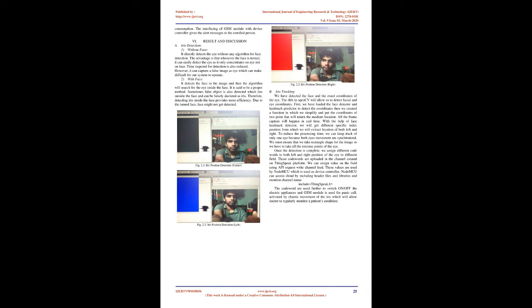5. Implementation. A. Raspberry Pi camera module. The Raspberry Pi camera module, 5MP, is a creation of the Raspberry Pi Foundation. This camera module of 5MP was launched in the year 2013. It has both visible light and infrared versions. Its pixel size is 1.4 µm x 1.4 µm, sensitivity 680 mV/lux-sec, and sensor resolution is 2592 x 1944 pixels.